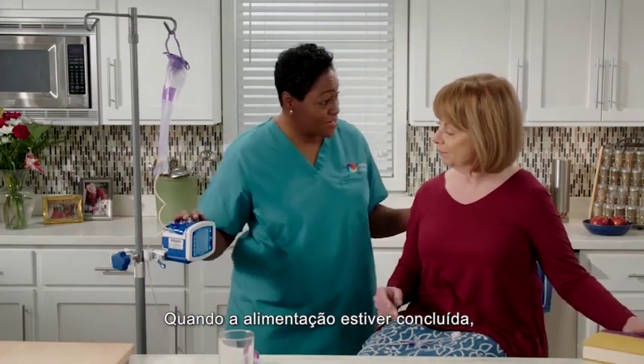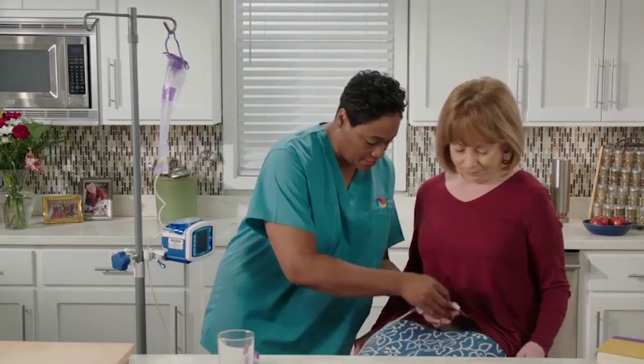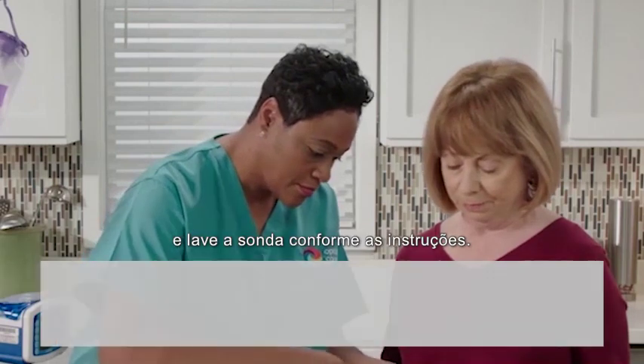Once the feeding is complete, press the power button to turn the pump off. Disconnect the feeding set and flush your tube as directed.